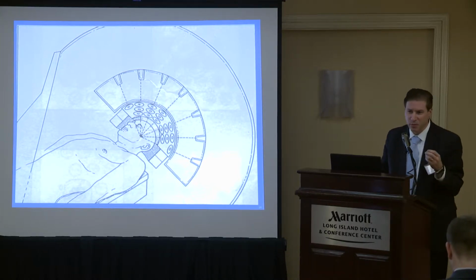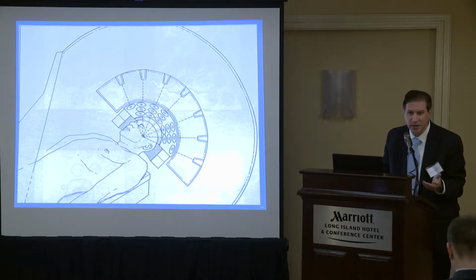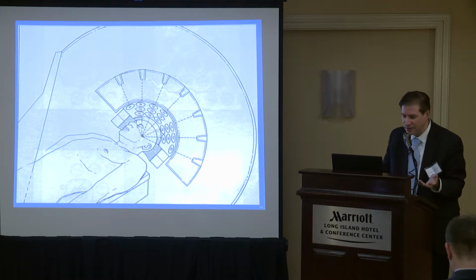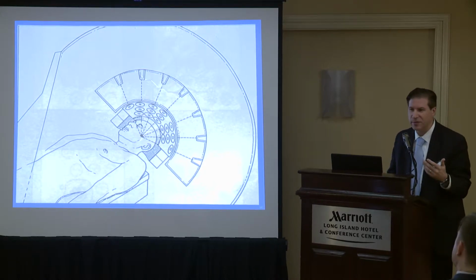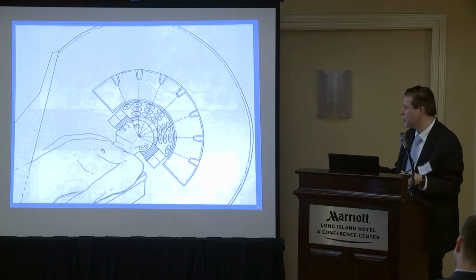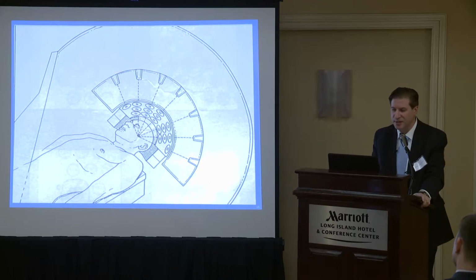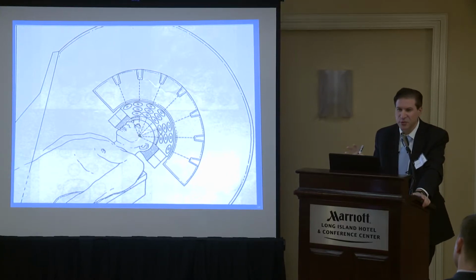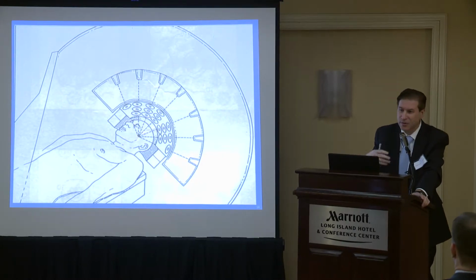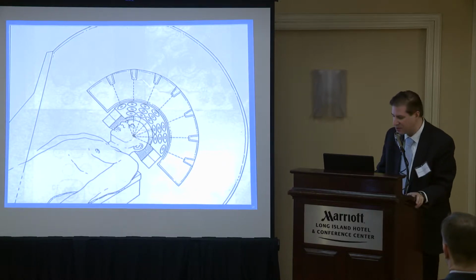One of the reasons radiosurgery didn't take off until the last, let's say, 15, 20 years, is it was very hard to see anything. Before you had CAT scans and particularly MRIs, even if you had this super focused technique, you didn't know what you were aiming at. So with the advance of MRIs in the 90s and better technology and better understanding of things, this really took off. Also, before they had MRIs, the only thing you could really see well was brain AVMs, because you could shoot an angiogram, you had X-ray capability, and that's why the earliest radiosurgery literature is on AVMs, not because they're the most common. In fact, they're now one of the lesser common indications for brain radiosurgery, but it was the only thing that could be seen at the time.